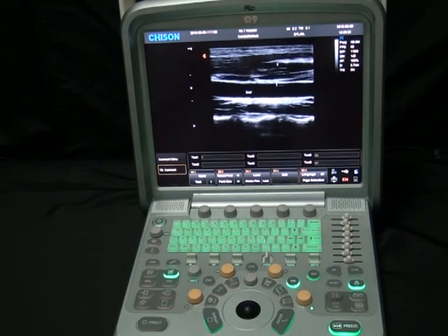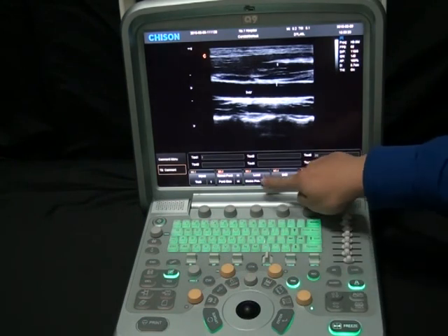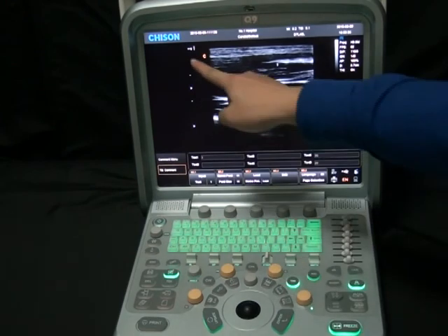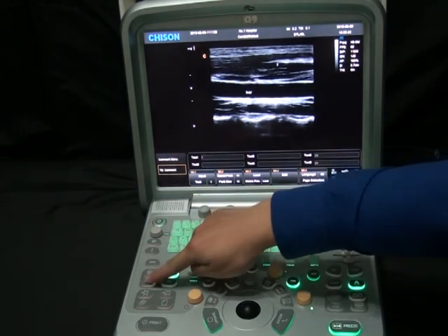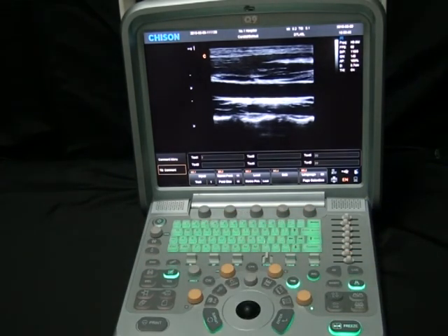We can change the font size, or we can reset to the original. We can change the home position by clicking Load. To clear those comments, we will use the Delete key. Just press it once and it clears all comments.